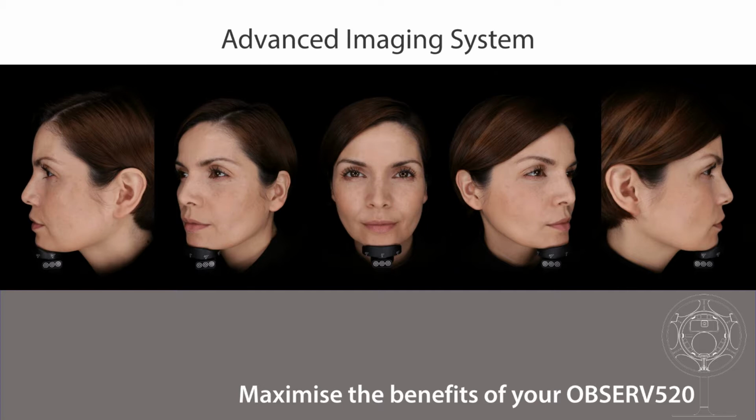With the aesthetic market that is now booming, specific cosmetic treatments such as laser, fillers, and injectables have become more and more common and easily accessible. The development of the AIS seemed to be the most logical next step to elevate the OBSERV 520 to the next level and to respond to the need of monitoring and documenting treatment plans and progress.